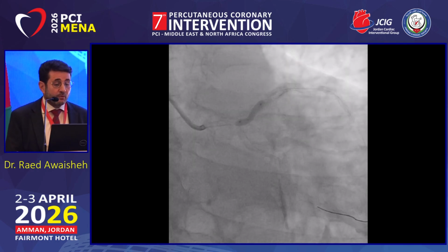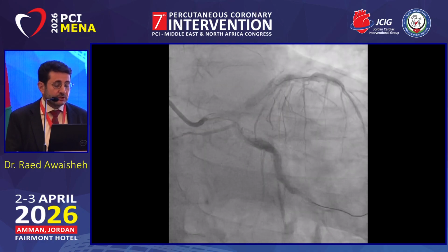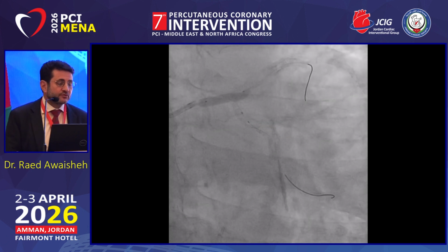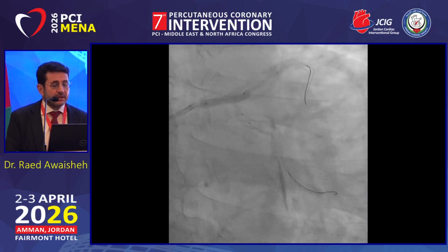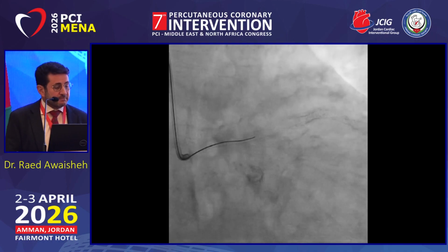This non-compliant balloon actually did nothing, as you can see here. And the OPN balloon, as mentioned by Dr. Fadi, ruptured. This nodular calcium is very sharp, and it caused rupture of the OPN. Luckily we didn't have any complication, so now we go for the extraplaque approach.